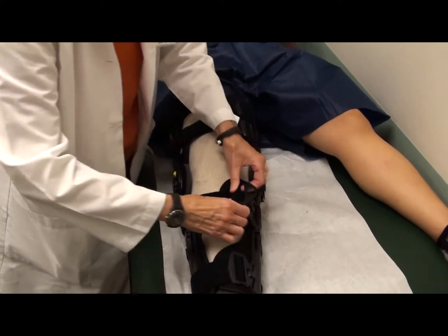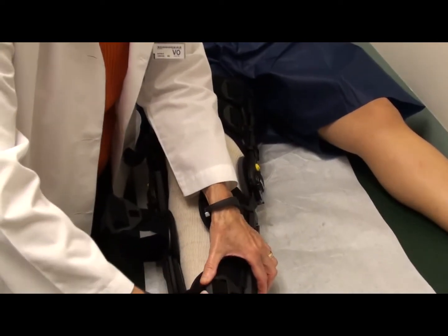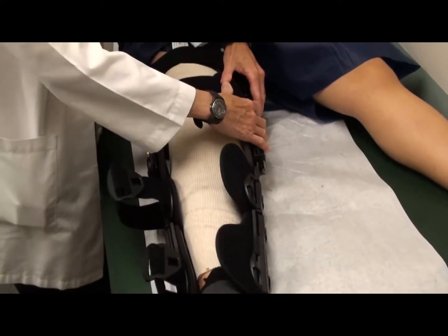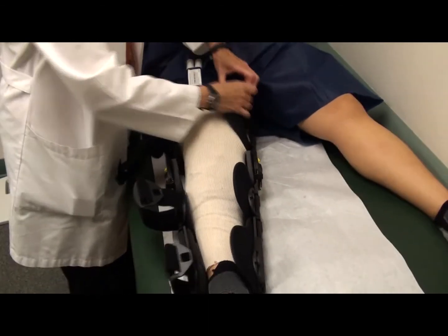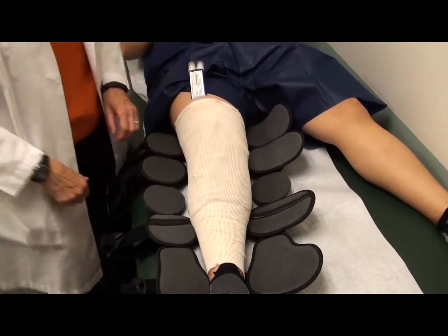So when you want to change your dressing, the straps come off. They hook over a small connector over here, and you just loosen all of the straps first. When you do that, this brace will open up like a book. You can just leave the brace there.